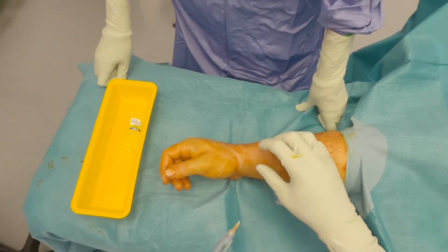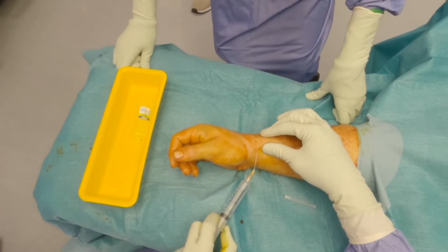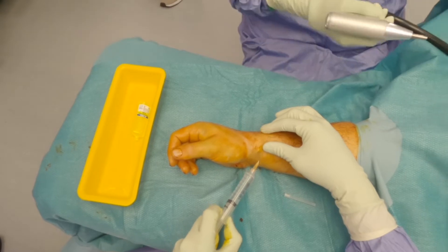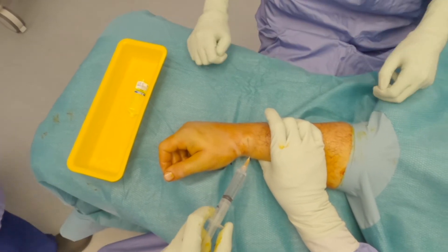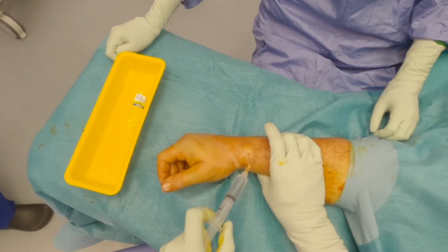Under general anesthetic and standard prep and drape, a local anesthetic block was administered first. The first CMC joint receives innervation from almost all of the nerves entering the hand, including the deep branch of the ulnar nerve. Its biggest contributor is from the superficial branch of the radial nerve, so particular attention is paid to block this.